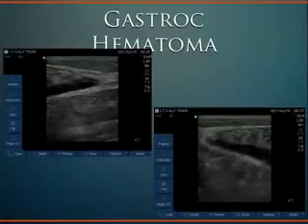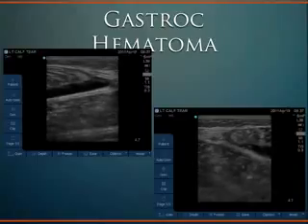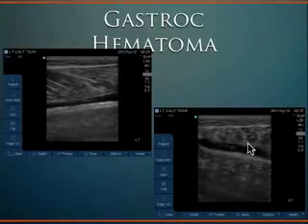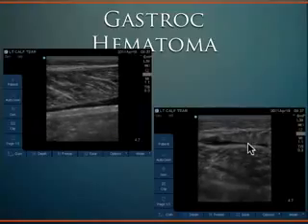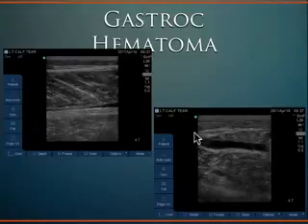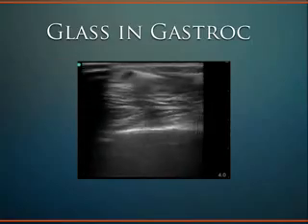Come back through here. Okay. So as you move along here, any fluid collection or hematoma is going to be compressible, and you can use that dynamically to kind of aid in your analysis as well. But what you'll see, and I'll have a later picture of this as we talk about some of the pathology, but you'll see actual disruption in the muscle tissue, retraction of the muscle fibers, and then what you'll see is this kind of corresponding hematoma fluid collection.